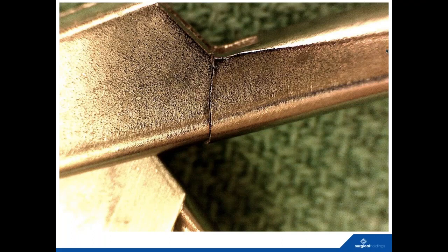so you pick up that it might have been overstrained. We've seen delicate artery forceps be used on bigger, bulkier areas of tissue, and they put the device under strain, and you get these micro cracks, which will gradually expand. What we tend to do when we're testing the instruments in-house before they're shipped out is put them under a stress test, so you force this cracking to happen on devices if they're faulty before they go out into the field. So that's how we try to avoid that. So maybe even implementing something like that in your department could be a good measure.